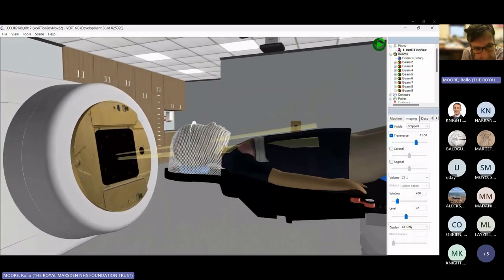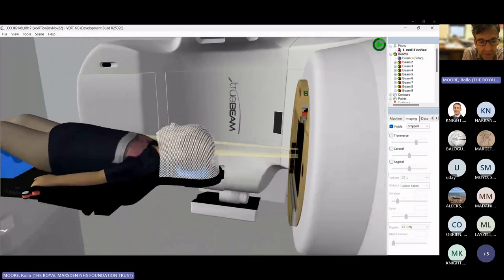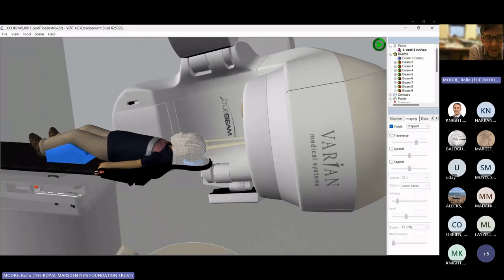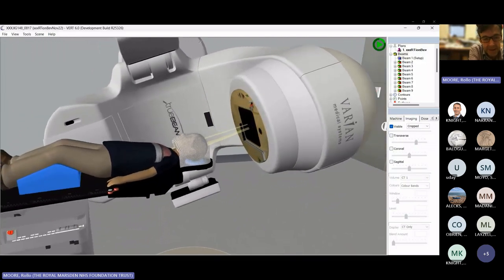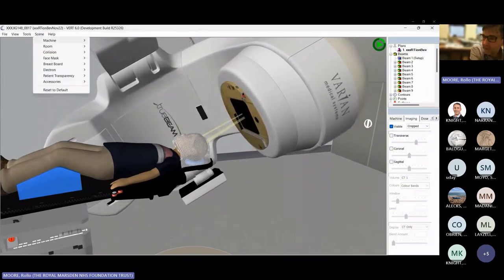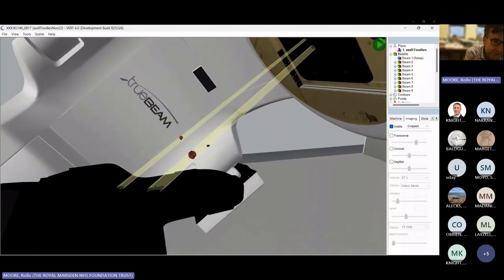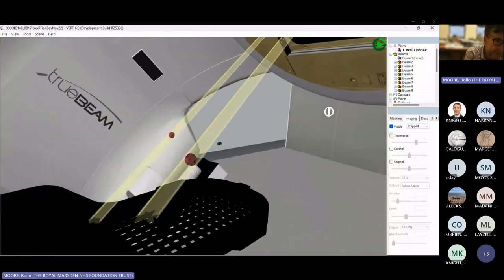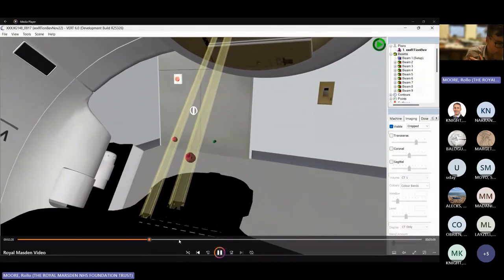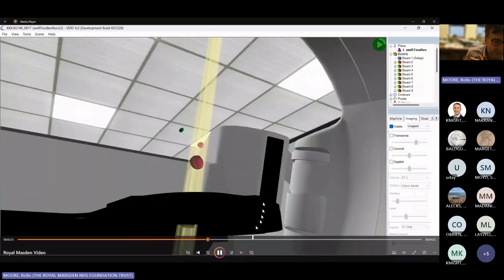I'll show a little bit more, but that was the key idea that I wanted to introduce, the relationship between the geometry of the CT scan and, in this case, the linac rotating around the patient, because it's very similar to the way that the robot in the CyberKnife moves around the patient. And there the patient has been switched off, as it were, and the lesions are there floating. I will attempt to move it on a little bit because there are some quite interesting angles.